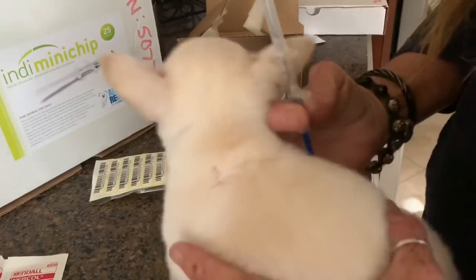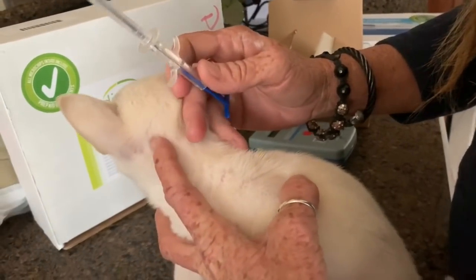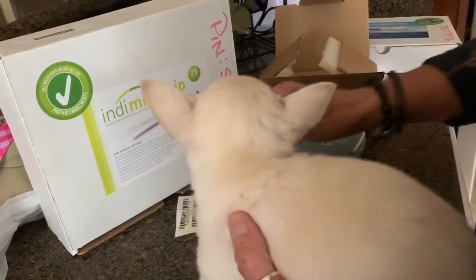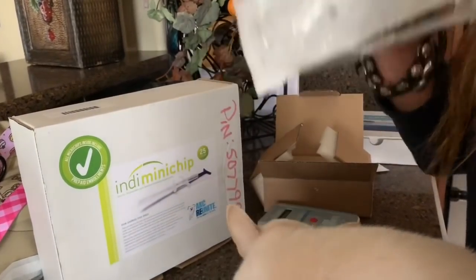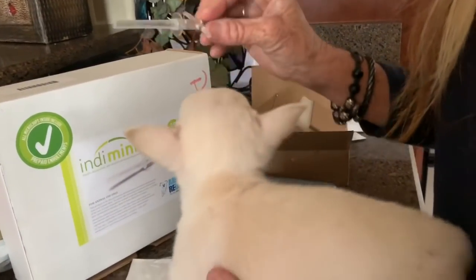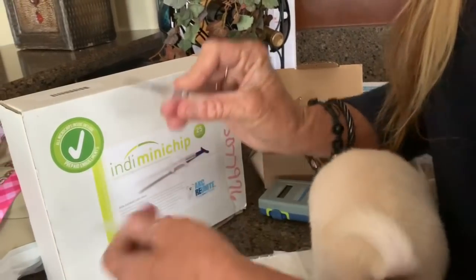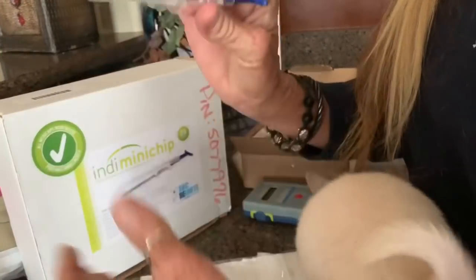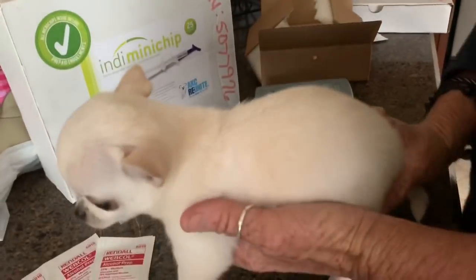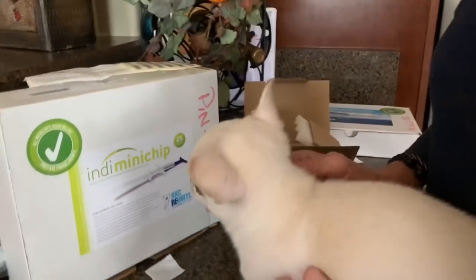These are sterilized — they come sterilized in the package. The package is sealed and sterilized so that no outside germs can get inside of it, and your needle is inside. This is sterile, so you don't want to touch the needle to anything once you take the cap off. So we've cleaned his little spot, and he might not like this at all.